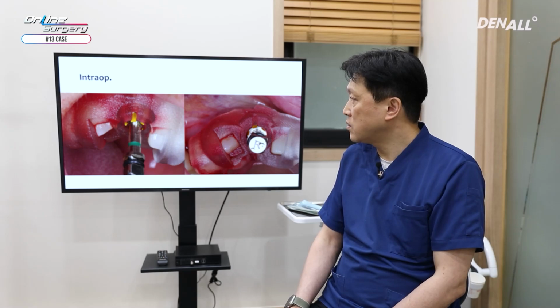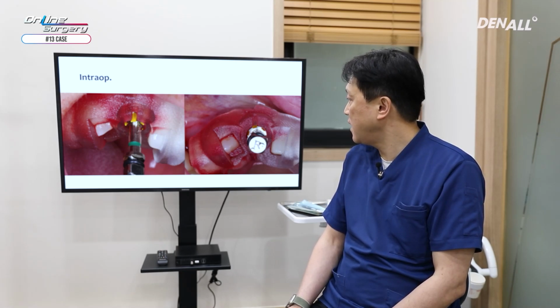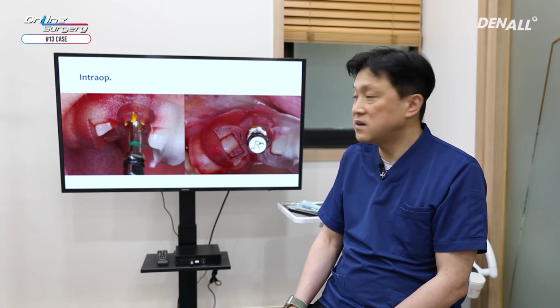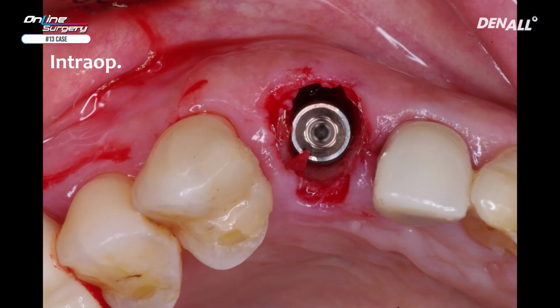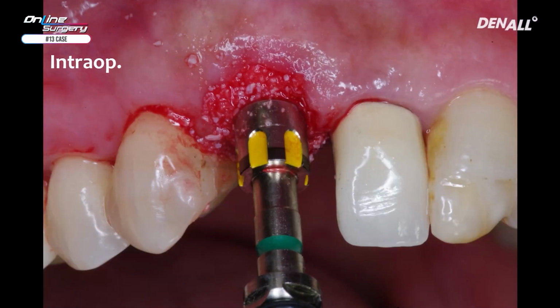If you look at the slot on both sides and buccal and occlusal view, the implant was placed accurately. You can see that there's significant buccal gap after implant placement. AOS collagen was used for bone graft.